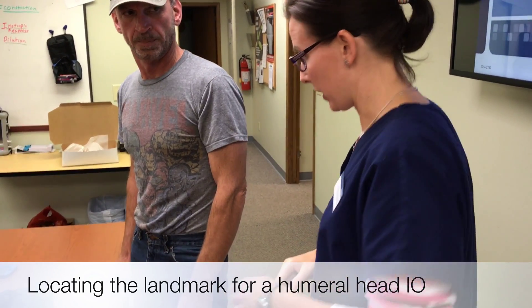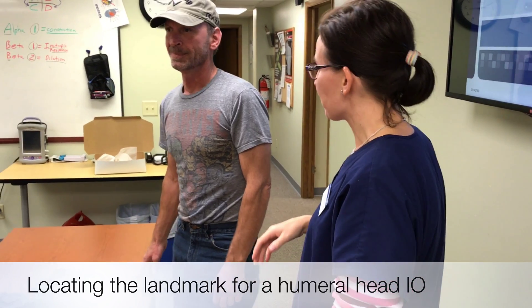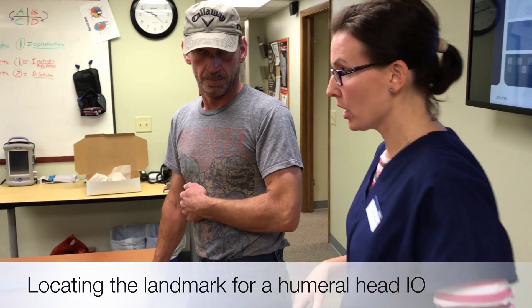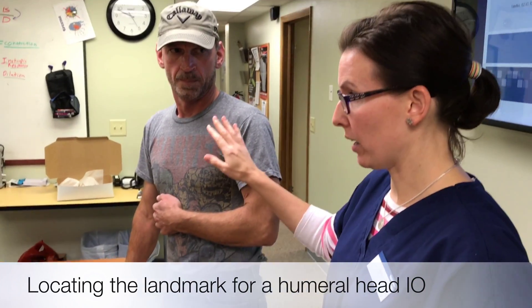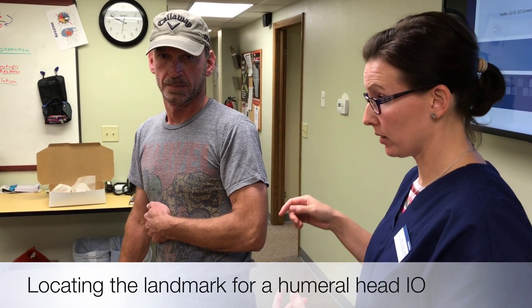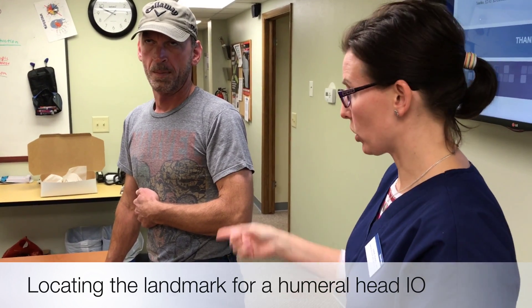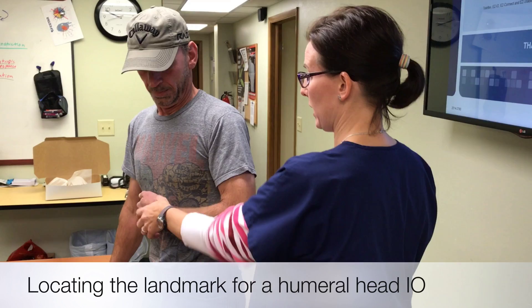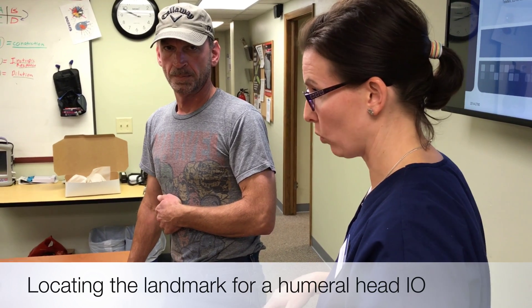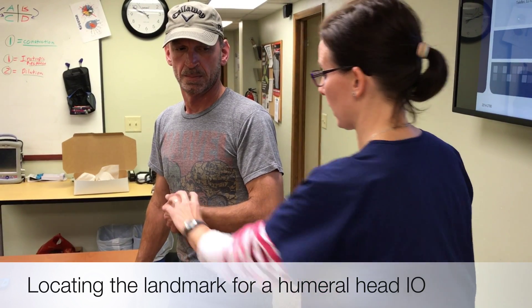The next thing is to position the arm in the right spot. The first way taught in cadaver labs is to put the person's arm across their belly. But a lot of folks don't have flat bellies, so if the patient is pregnant, has ascites, or is obese, doing that rotates the biceps tendon back toward where you're inserting — that's a structure you don't want to hit with a 15-gauge needle. It's not ideal. If you're doing CPR you also don't want arms in the way.